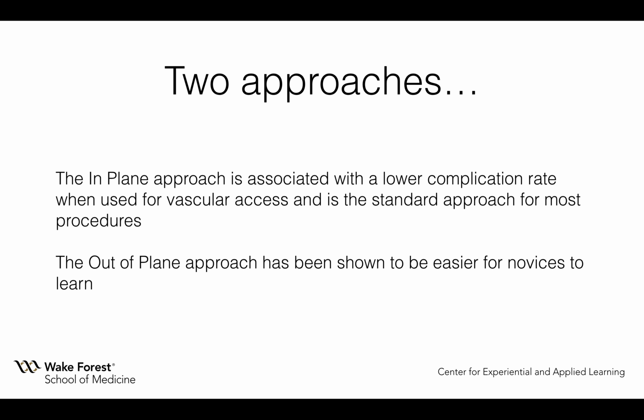And so it's important to keep in mind, and this would be important to remember, that the in-plane approach overall is associated with fewer complications, especially when we're using it for vascular access. And it is the standard approach for most procedures where the probe will fit in the space that you need to use the in-plane approach. The out-of-plane approach, although it has some drawbacks, overall is easier for beginners to learn. And personally, I found it to be much more successful when the target is small. So small targets are hard to keep underneath the ultrasound probe in the in-plane approach.